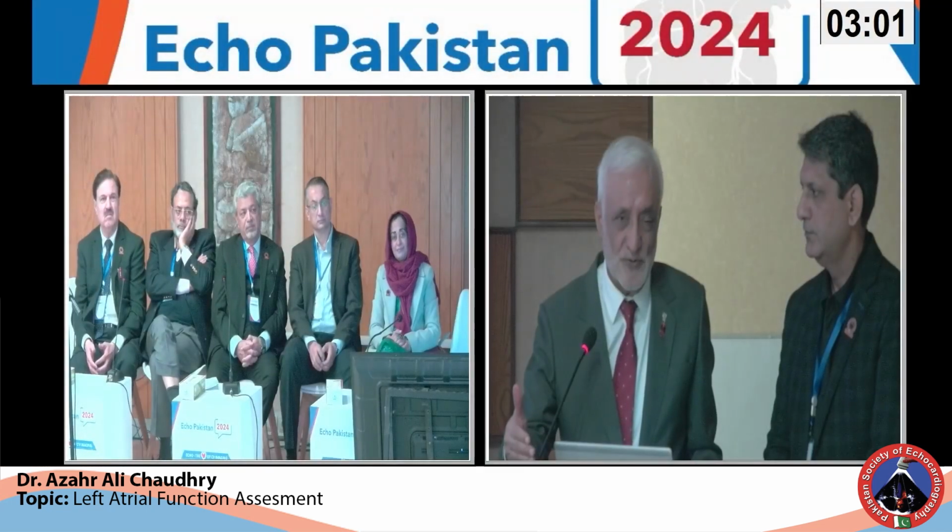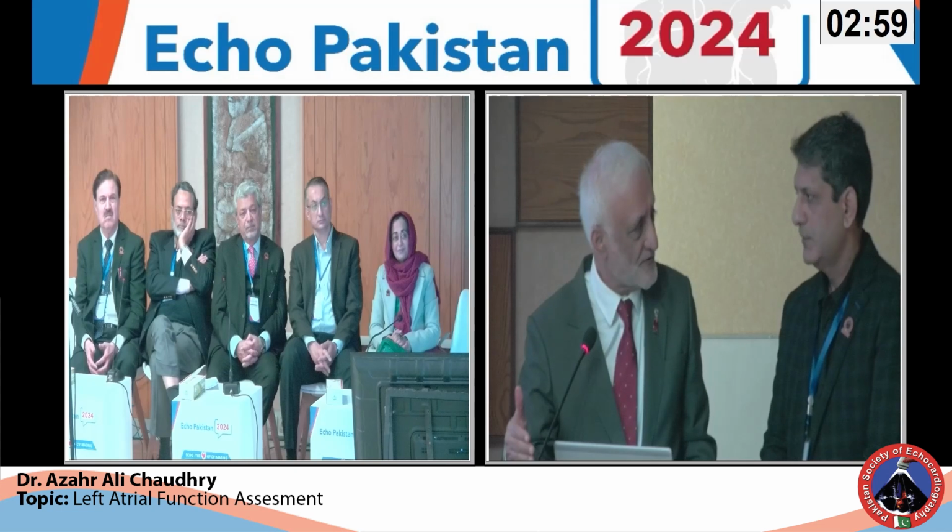Thank you very much for a very lucid presentation. And it is so important now that instead of measuring the left atrium, we should be measuring the left atrial volume index in all patients that we see, number one. Number two, when we are doing a left atrial strain, can we detect those patients who will ultimately go into atrial fibrillation, who have the risk factors?